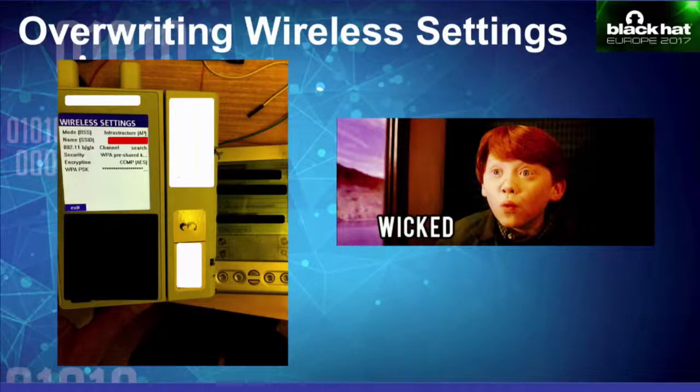So we were really excited about it. We opened up the app, looked at the network settings, and there was nothing in there. So I think someone on the manufacturer side figured out that it's generally a bad idea to export these settings to a foreign device, so they blocked it. That's really good of them. All we received was a blank template. There was no data in there that could be used.